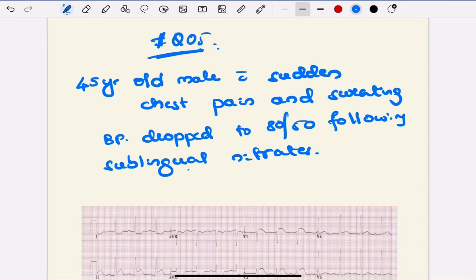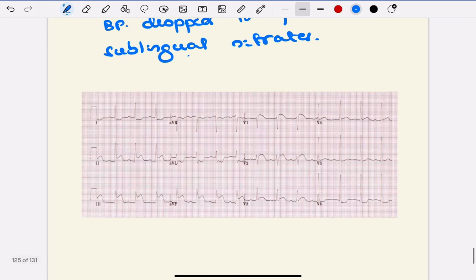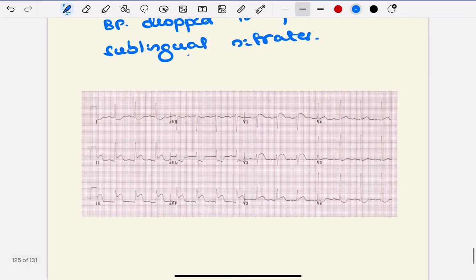Hello friends, welcome to Cortex YouTube channel. In the last shorts video, I asked this question: A 45-year-old male with sudden chest pain and sweating, BP dropped to 80 by 50 following sublingual nitrates, and an ECG is given below. What's your diagnosis? Let's interpret the ECG.